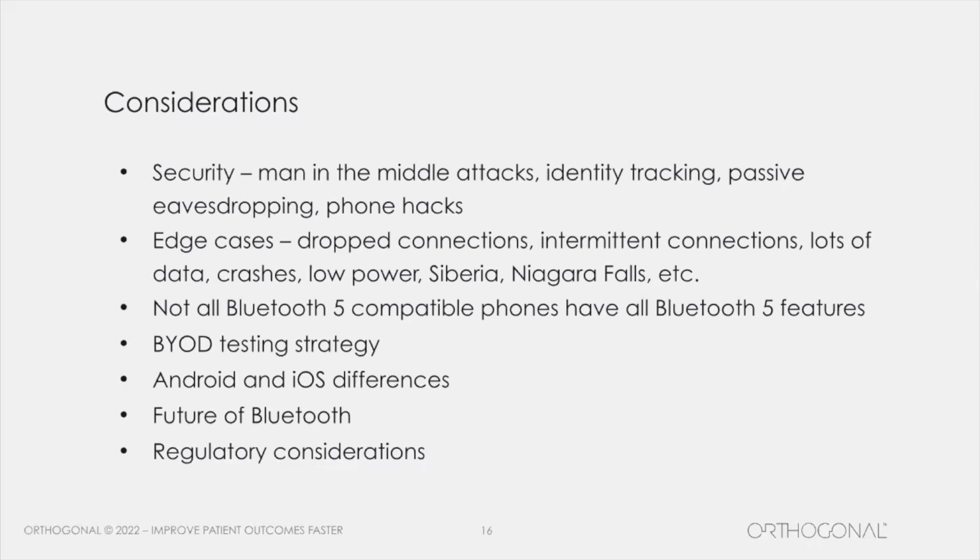And last but not least, there are the regulatory considerations. Early on when we were first doing mobile apps that were part of an FDA filing, the FDA actually asked for human factor studies to see whether someone could download the app from the App Store. Those aren't things that they care about anymore. They don't see that as a big risk.